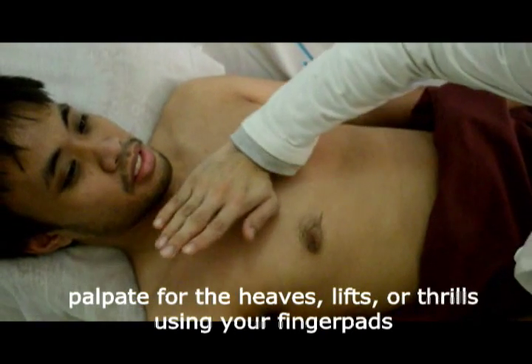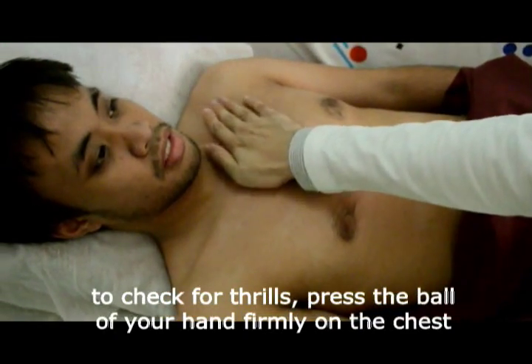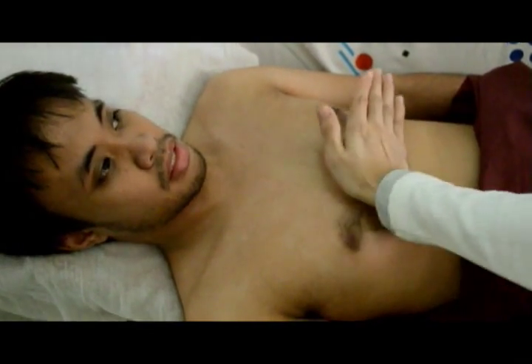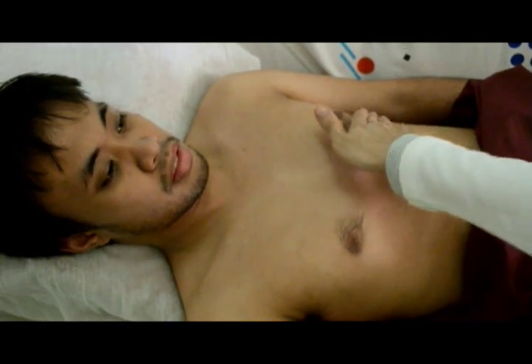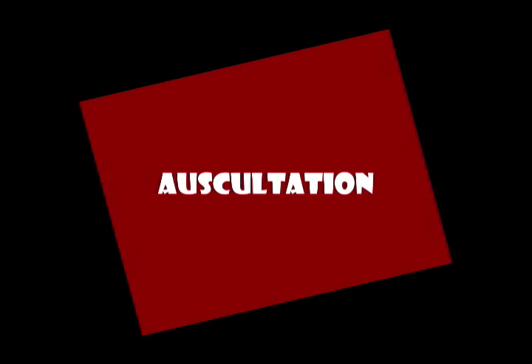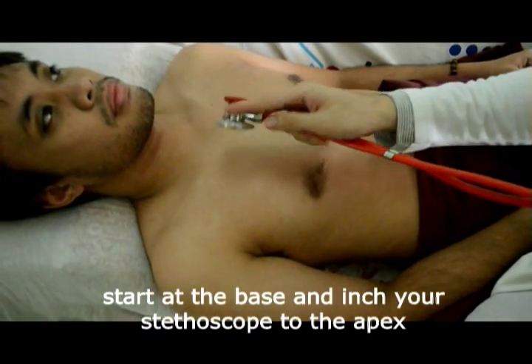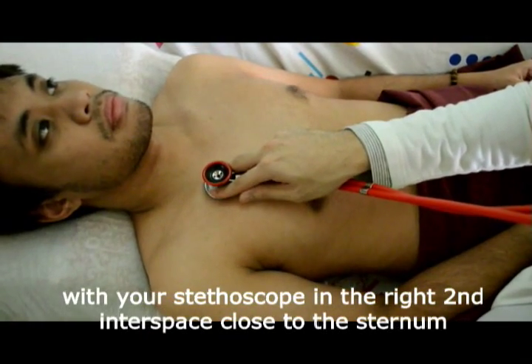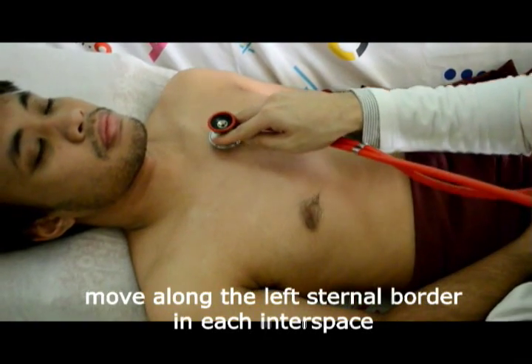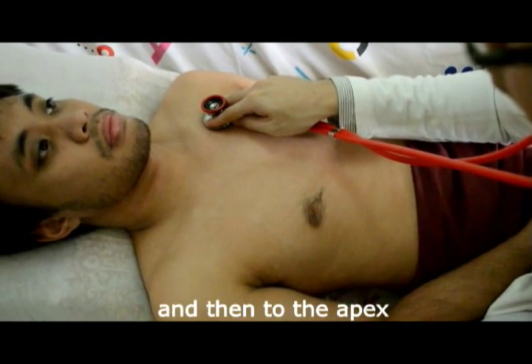Palpate for heaves, lifts, or thrills using your finger pads. To check for thrills, press the ball of your hand firmly on the chest. Start at the base and move your stethoscope to the apex. With your stethoscope in the right second interspace close to the sternum, move along the left sternal border in each interspace from the second to the fifth, and then to the apex.